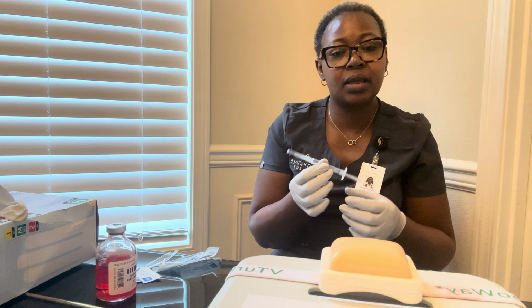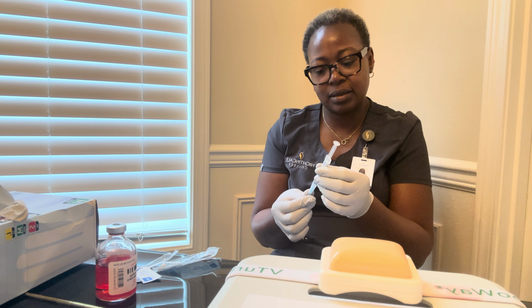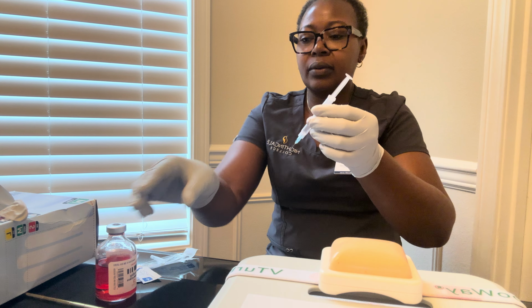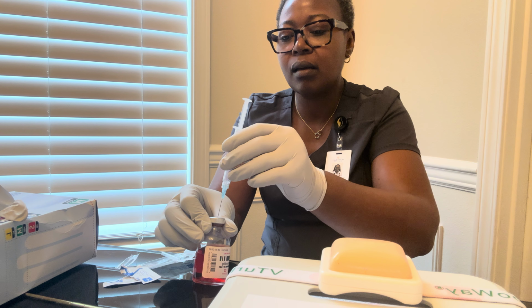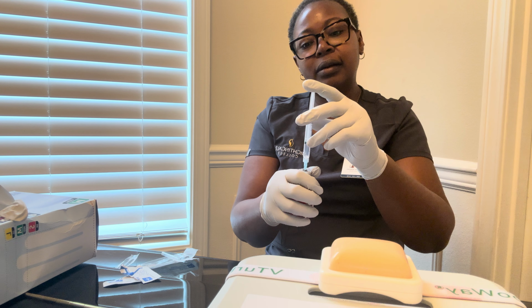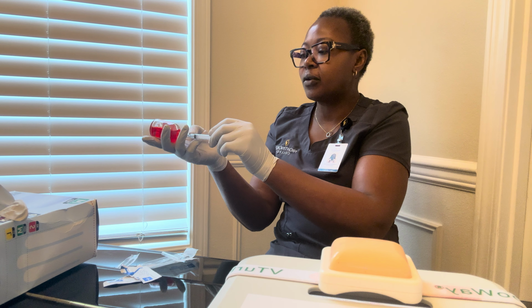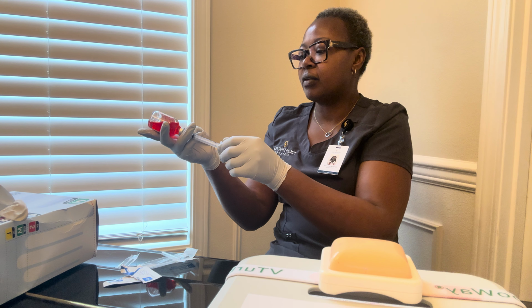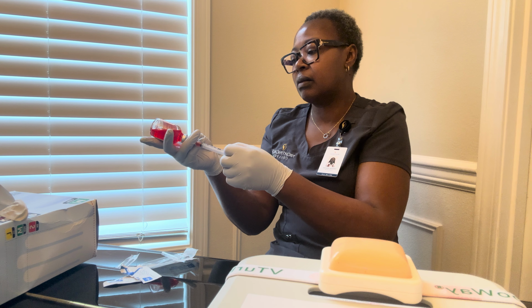And then before I invert the vial, I'll go ahead and inject all the air into the vial, and then I will invert and draw 1.5 ml of medication.